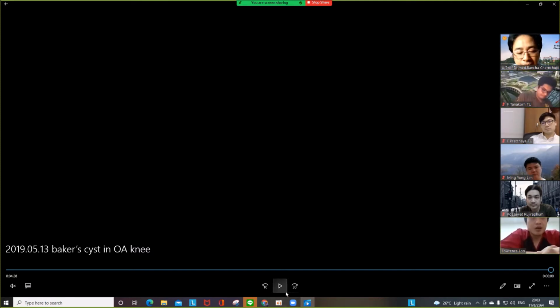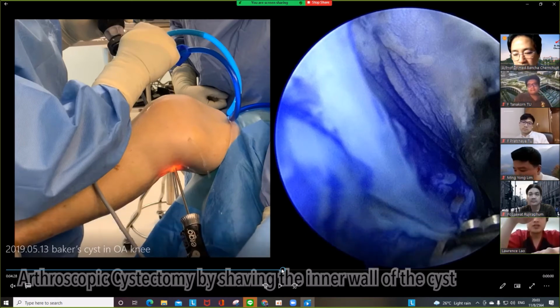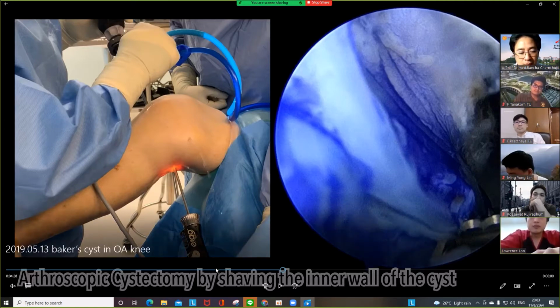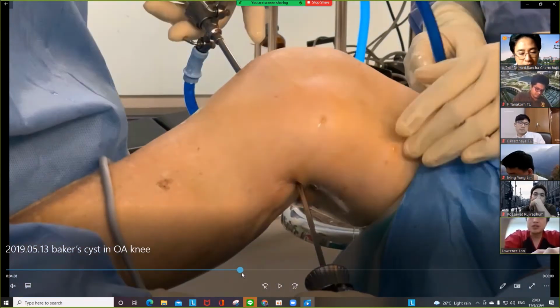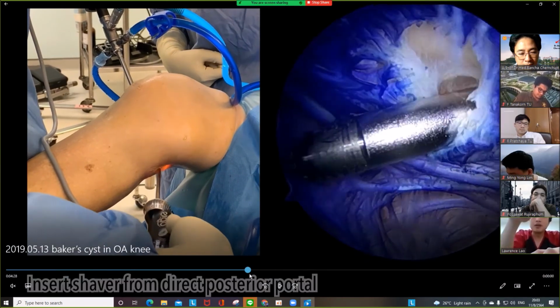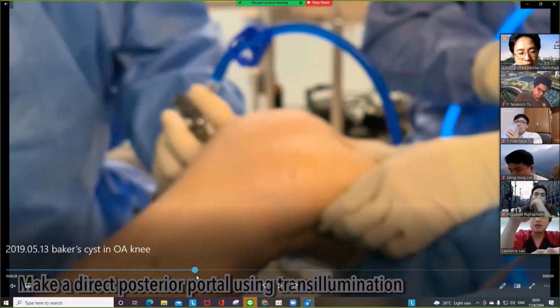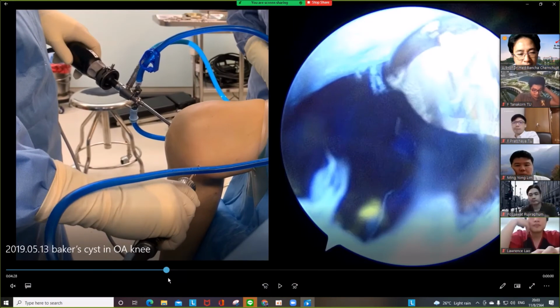Yes. Because previously when you showed the valve, it's usually quite large, and in this patient you can see that there's a tissue covering the valve and it's very good. So in your experience, the normal valve is usually a big hole, right? Yeah, right. For normal patients. For those with Baker's cysts, some patients you cannot see the valve very well, like this patient.